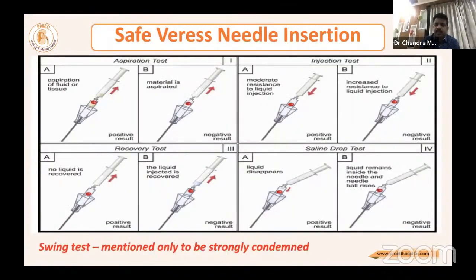Another most important thing is if you have any scar, particularly women who underwent tubectomy or hysterectomy, when you are doing surgery, even if it is nephrectomy, don't go nearer to the scar. At least 2 to 3 centimeters away, you go for the trocar as well as the Veress needle. Even a Veress needle just above the scar is dangerous because you can go into the bowel.